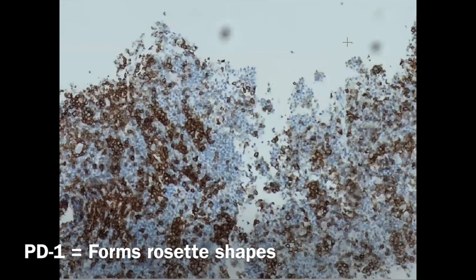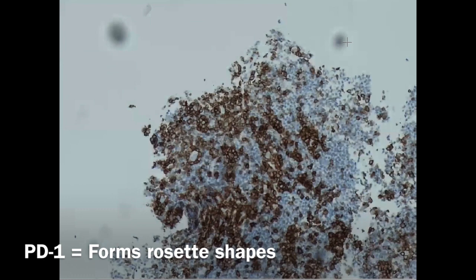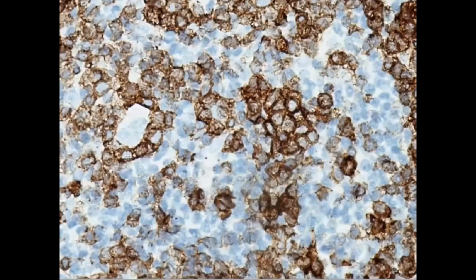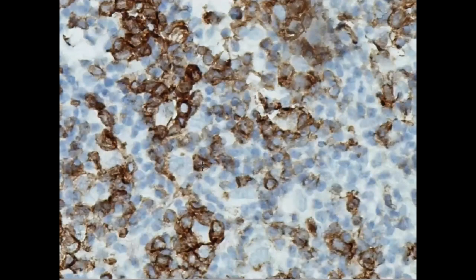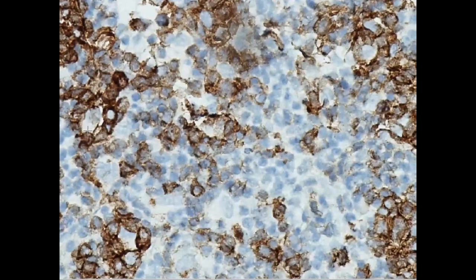Now let's see an important feature: with either PD1 or CD57, we can see how the T cells stain and surround these big cells forming rosettes. This is another feature that helps diagnose this entity. From low power, can you see this rosette? These are T cells stained by PD1 surrounding this large LP cell. At higher power, we see this beautiful rosette with T cells surrounding the LP cell. We have many rosettes here — another rosette with T cells surrounding LP cells.